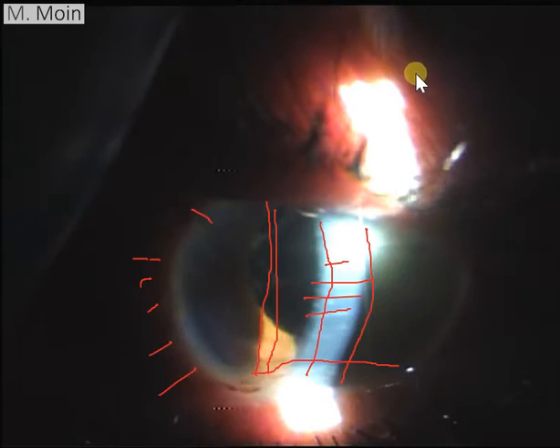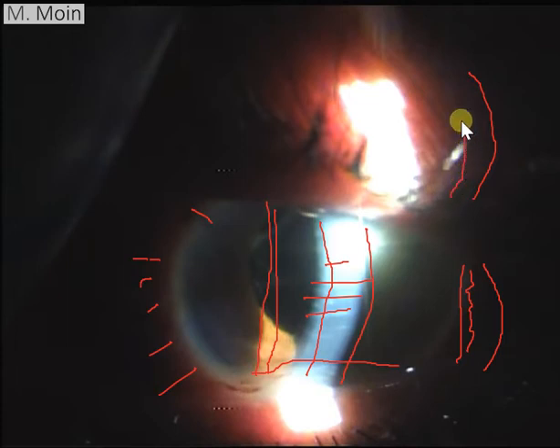Let me just refresh what Descemet's membrane folds represent. If this is the cornea, with corneal edema the posterior surface becomes flatter. So that's why the Descemet's membrane becomes more redundant and it makes folds like this. Otherwise, normally the posterior surface of the cornea is curved like the anterior surface, so you do not have any folds in the Descemet's membrane. So this is the Descemet's membrane which gets folded because of thickening of the cornea. So let's go ahead with this.